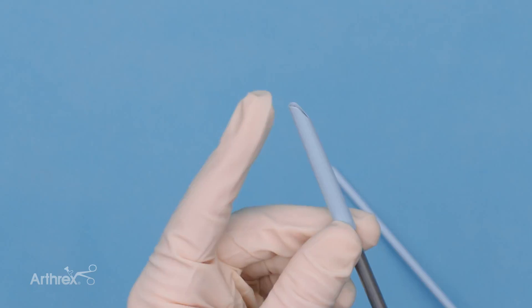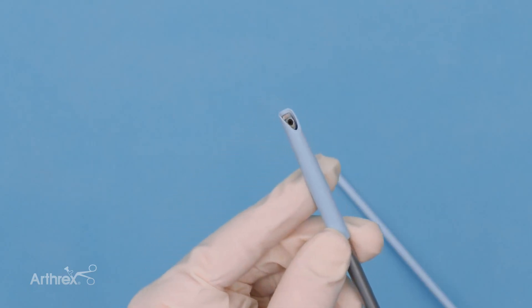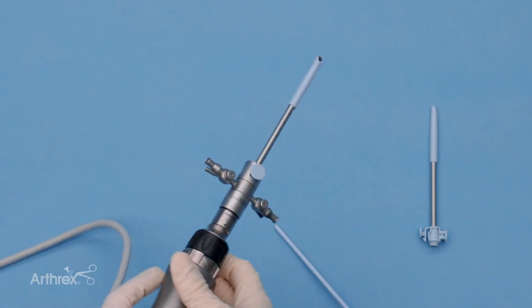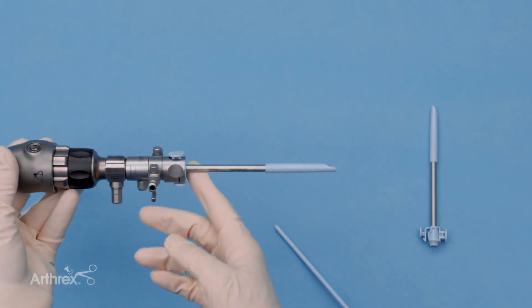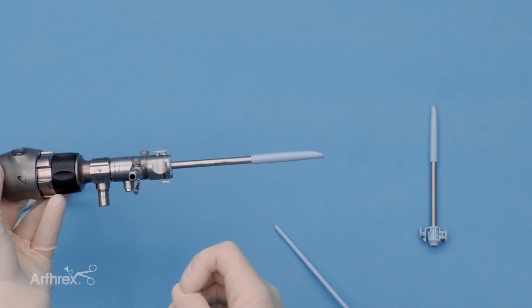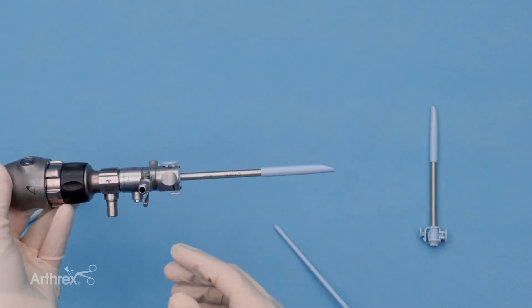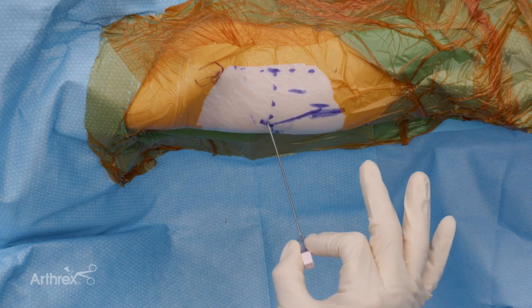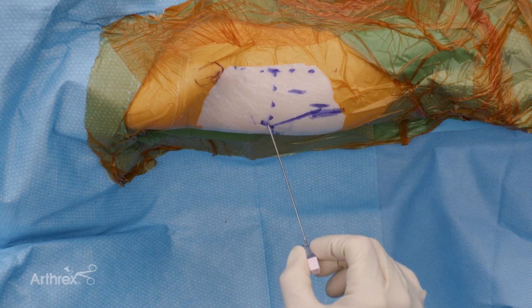Inside the softer cannula, we can really see the protective features for the articular cartilage with the way this fits. It's also important to note that your standard working length is 125mm, but longer options are also available if needed. When starting with our standard arthroscope, we go ahead and start in the anterolateral portal where the needle is positioned.